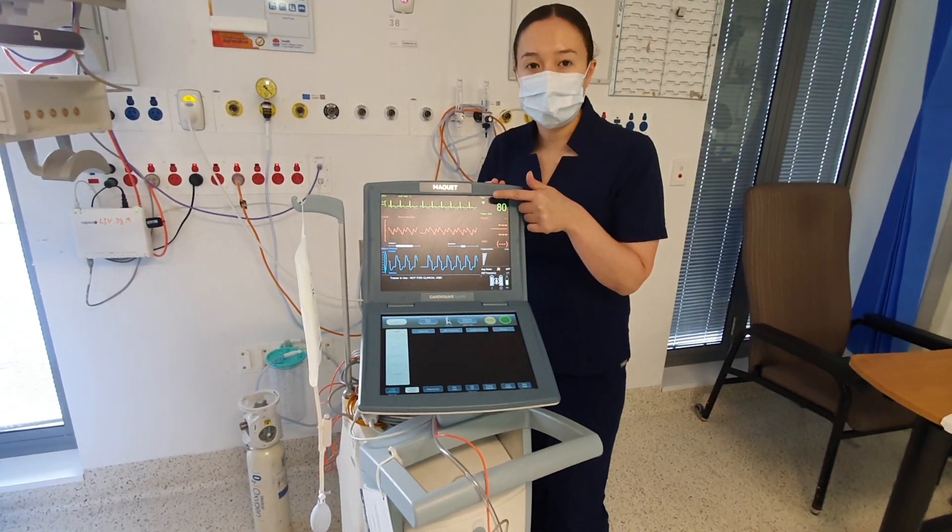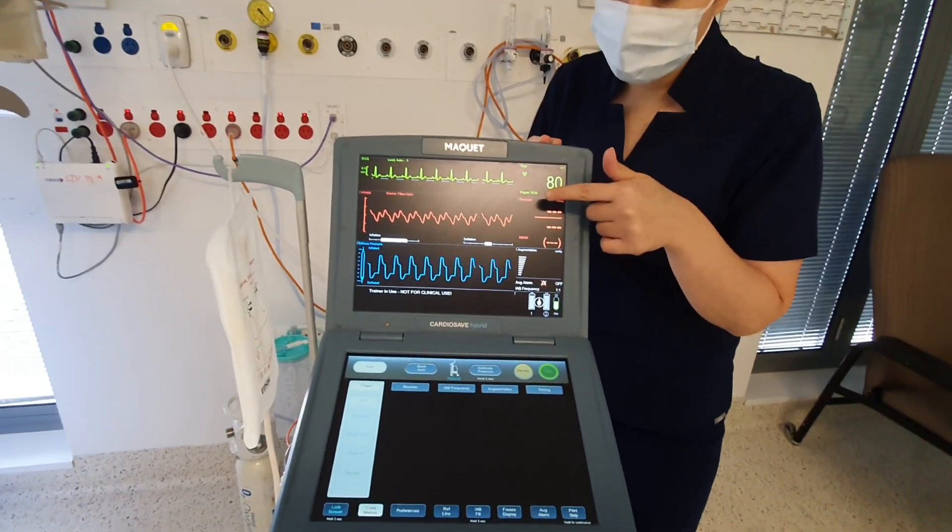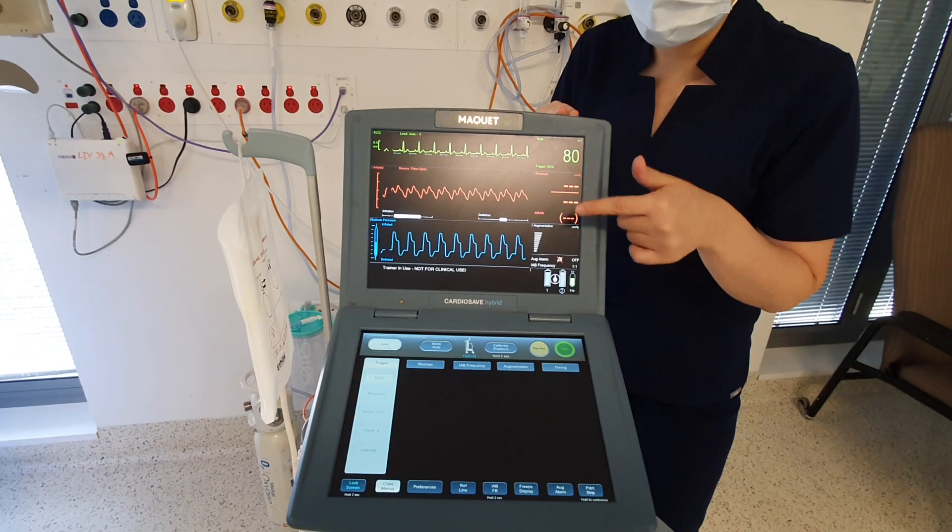On top here is your ECG waveform, this is your arterial pressure waveform, and this is your helium waveform.